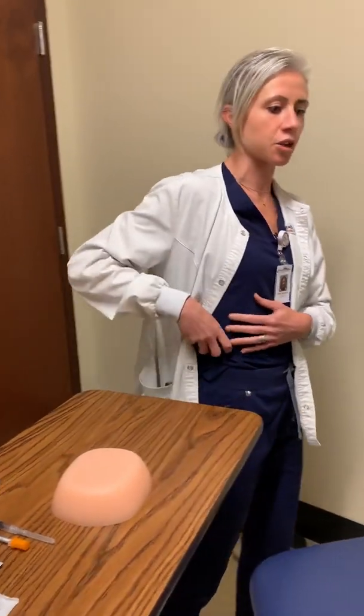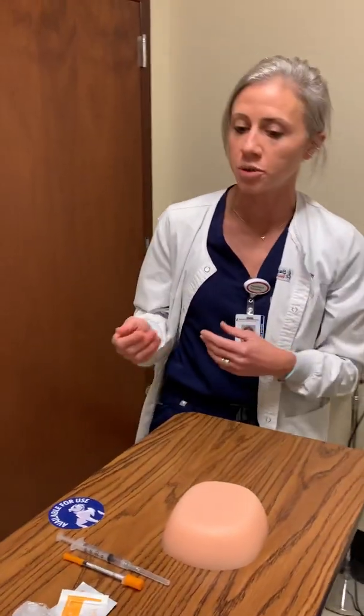So when I step over to Miss Mobley, I've found my site, I've gotten my gloves on, and then I'm going to, if she hasn't had this injection before, guys, always explain this to them. You know, nobody wants to be stuck, okay? So explain the procedure, why they're getting it, why are they getting a Lovenox injection. Hopefully they know why they're maybe getting their insulin. But I'm gonna go ahead and get the patient in a comfortable position. If you're giving something to somebody in their love handle, it would be most comfortable to lay them over to the side that is not receiving injection, okay? So I'm gonna get Miss Mobley to roll over to her side.